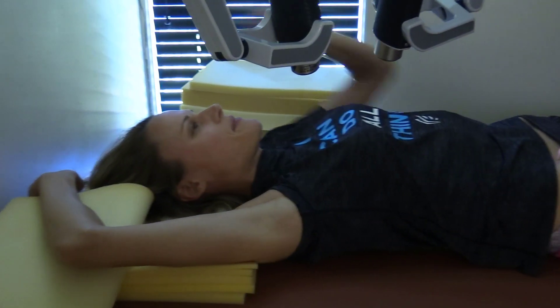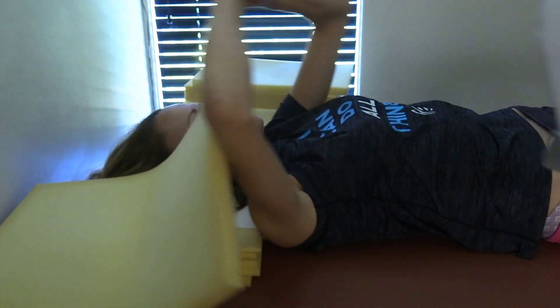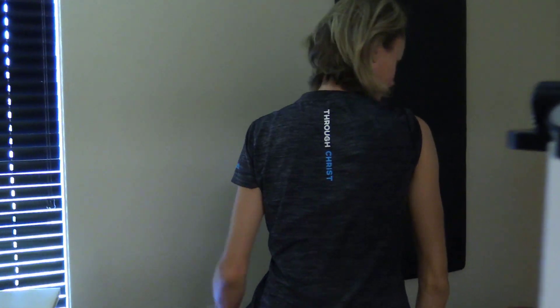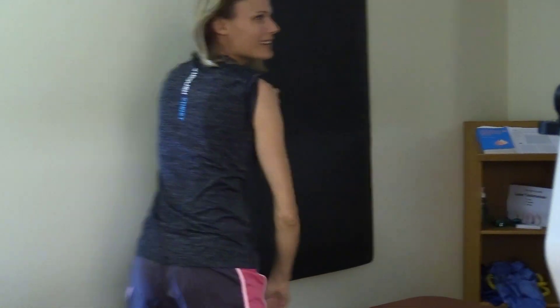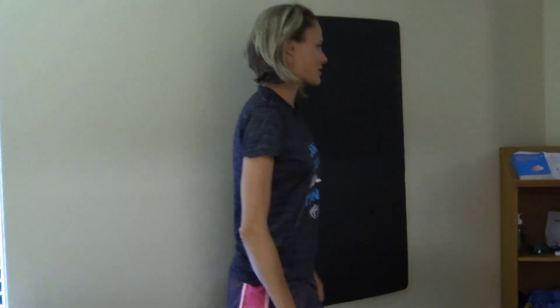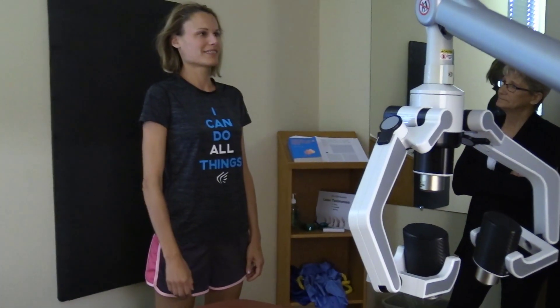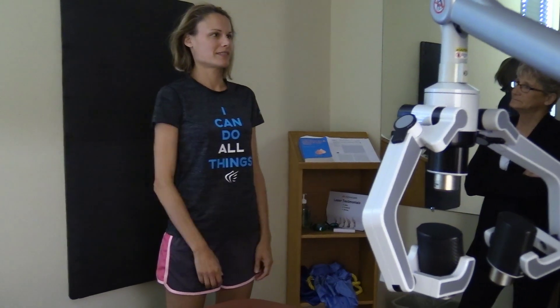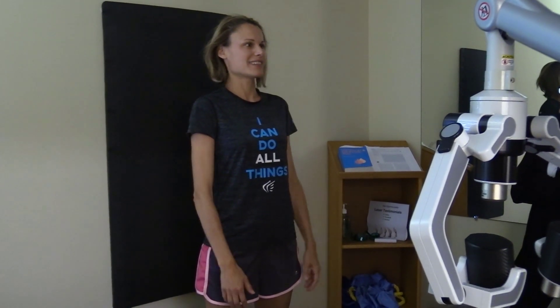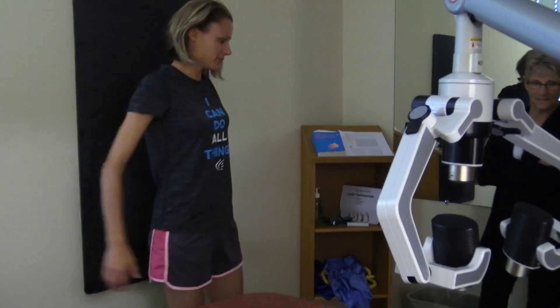It's just been 18 minutes and she's never had it done before — in the axilla at least. Was that a little uncomfortable coming down? She used her other arm to bring it down, but there was a little bit of weirdness. It definitely feels a little weird — looser, more comfortable, and like the arm is back a little bit more. [Practitioner confirms the result.] So do you want to do the other side? Balance them out? Because at least you got some change there — that's good.